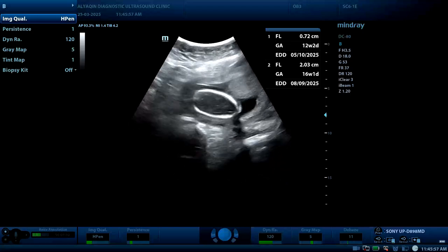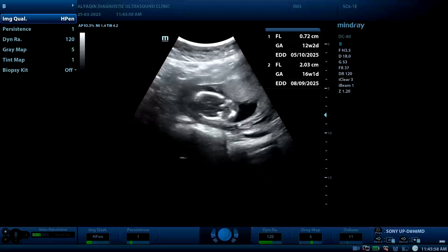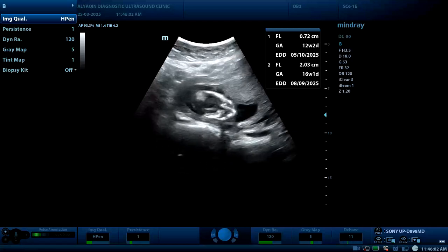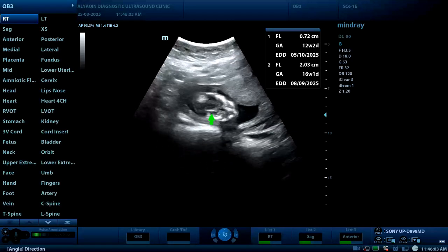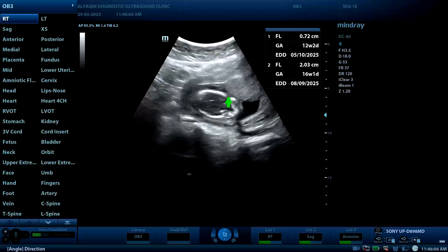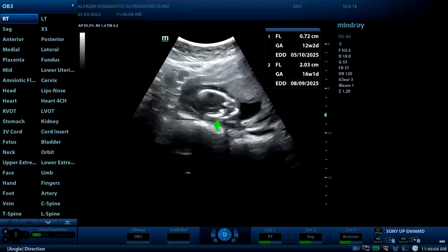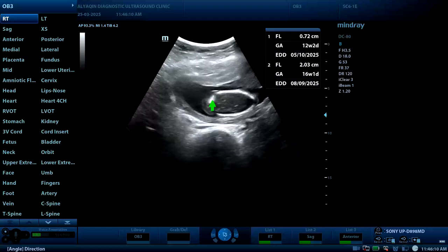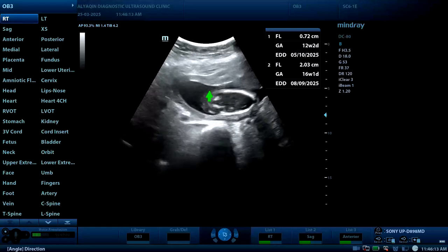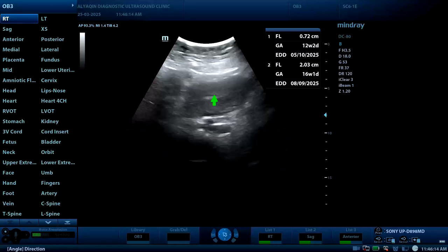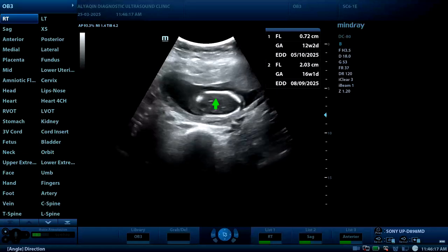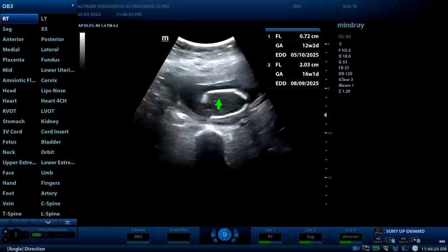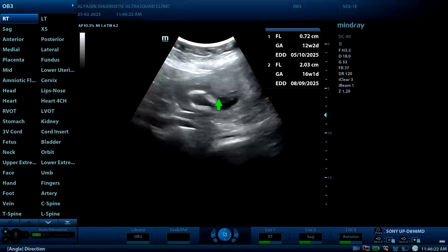The second finding is the shape of the fetal skull is elongated with superimposing of the skull bones — here and here — the so-called Spalding sign of fetal death, superimposing of the skull bones.